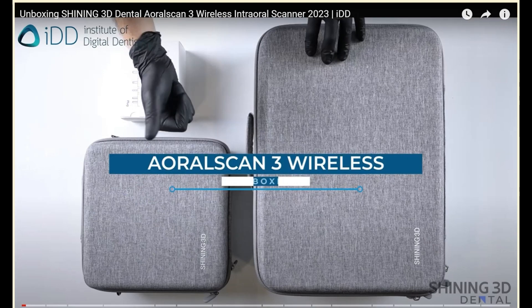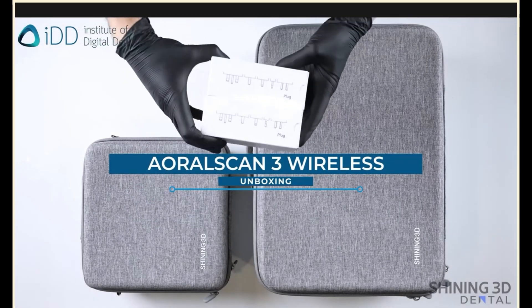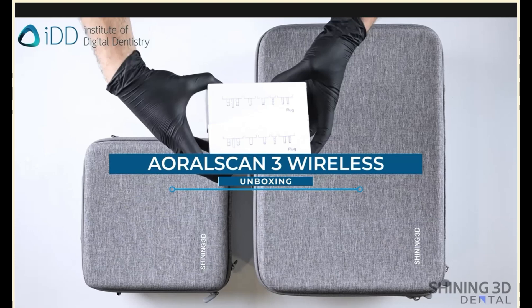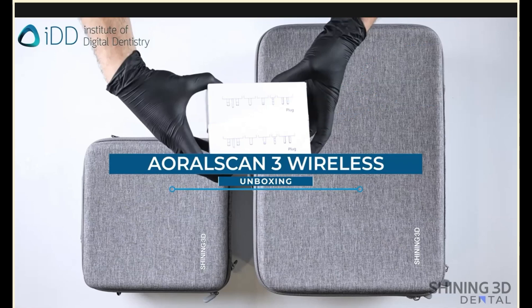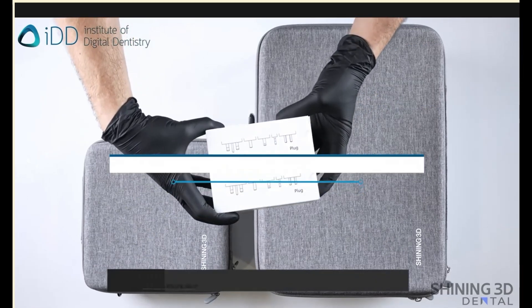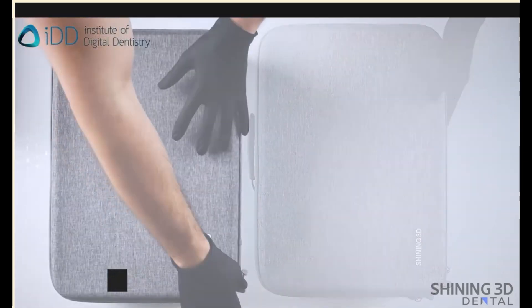When you acquire the AOS 3, you are delivered three parcels. There are two hard cases — one large, one smaller — and two cardboard boxes with international adapters for the power supply. The smaller case contains the accessories, and the bigger box contains the scanner.